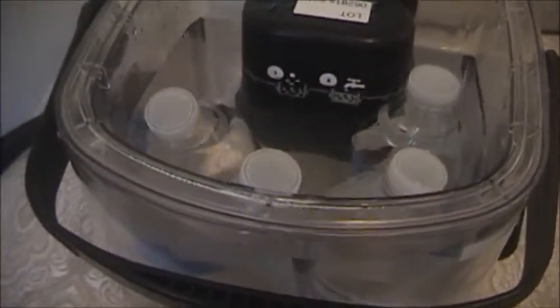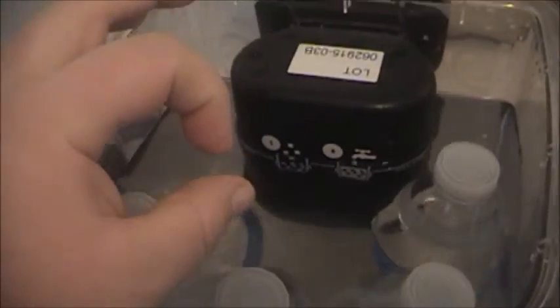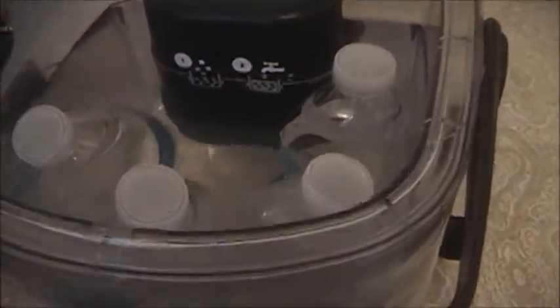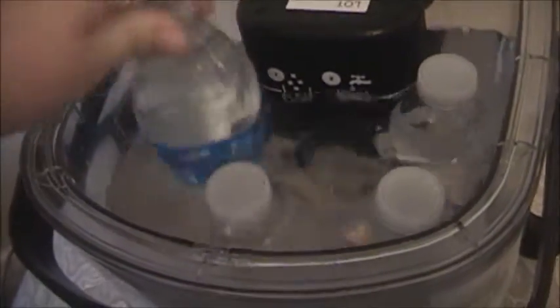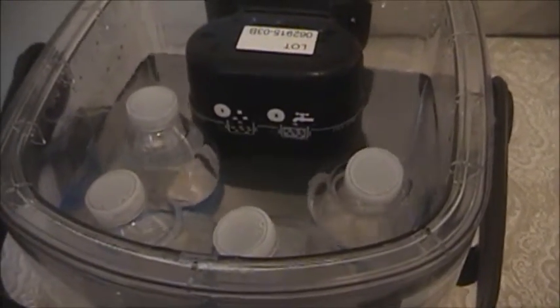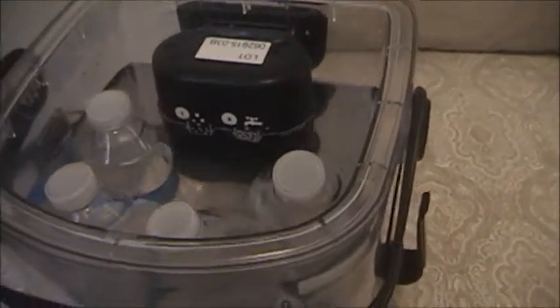And it actually stays longer than ice cubes, because think about it. If you're using little ice cubes, they melt off really quickly. And once they melt off, the water starts warming almost immediately. Whereas this is like one solid brick of ice. And if you guys know anything about science, when you have a bigger piece of ice, it'll actually last longer. So I'll have to give Dad kudos. My dad is a very mechanical person, and I'm glad he came up with that, because it seems to work very well for her.